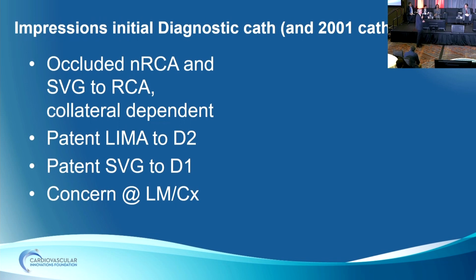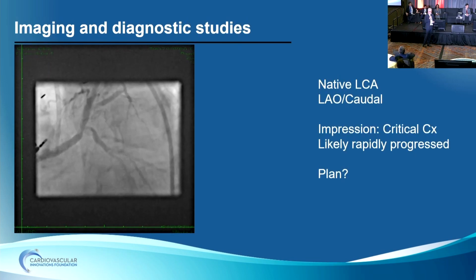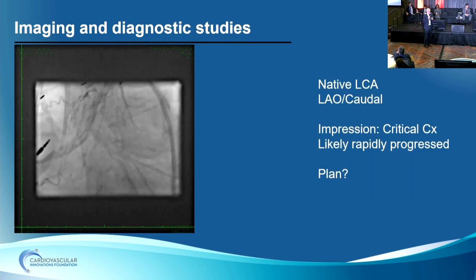Okay. It's not so much chest pain. So I think in that situation, interrogating that left main into circ a little bit better with either IVUS or OCT and seeing what's going on. Exactly. So he was referred over with an idea to do IVUS or something to look at that. And my partner actually did this cath, and all he had to do was a really steep, good LAO caudal.